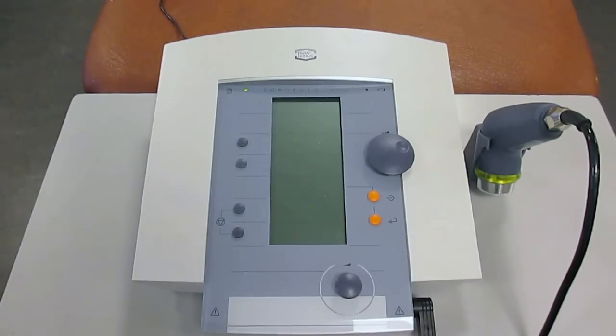This is a video on the Enrath Nonius Sonopulse 490, which is a therapeutic ultrasound often used by athletic trainers as well as physiotherapists for treatment of soft tissue injuries. In this video, we'll look at some of the parameters as well as some of the functions of this particular machine, what it can do.